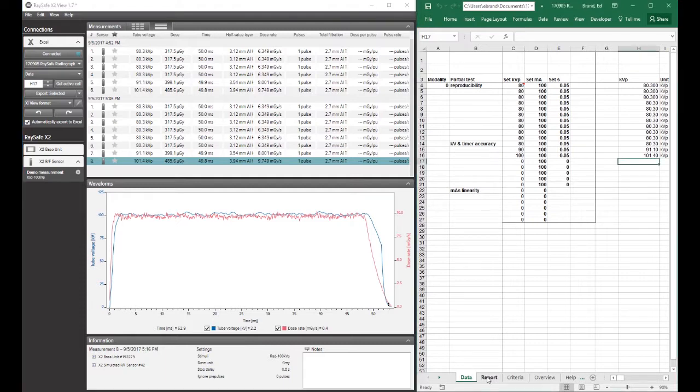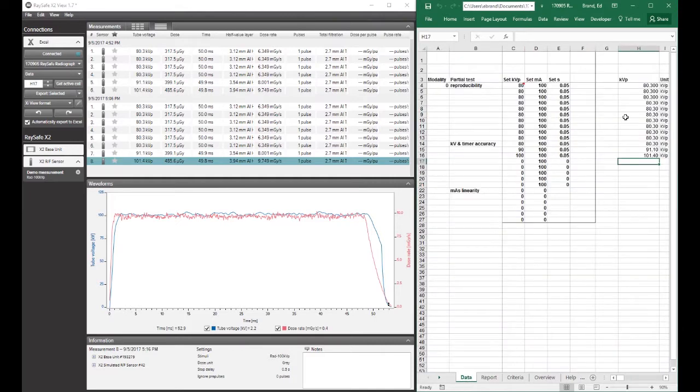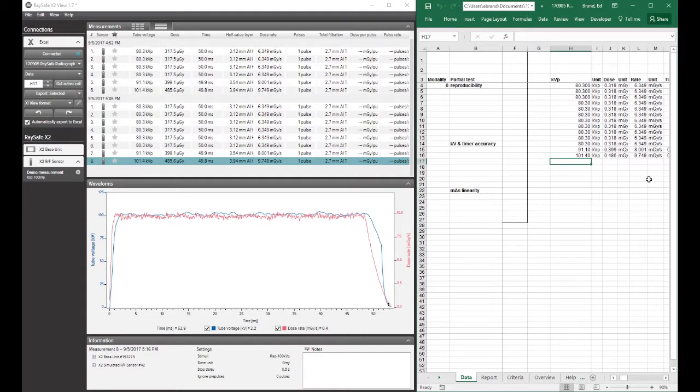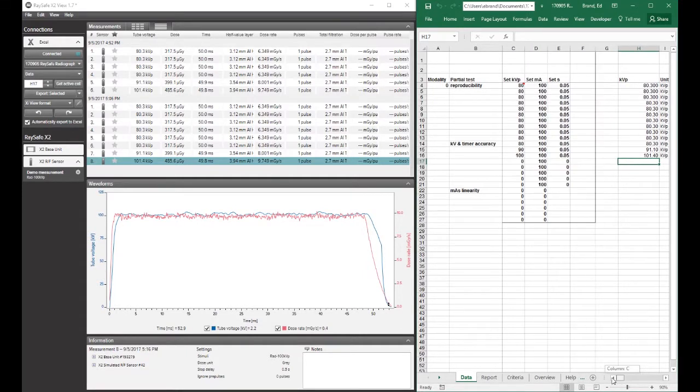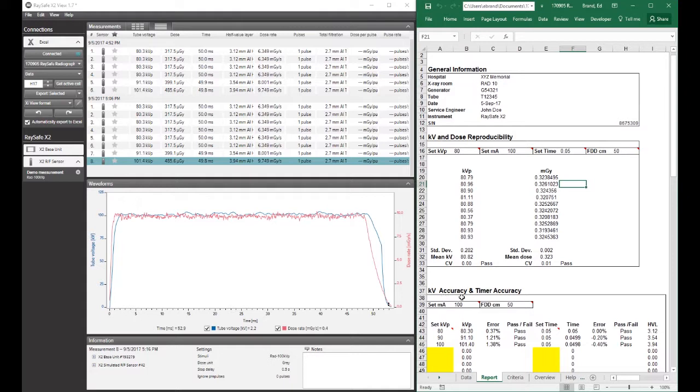So let's look at the report that we've generated now. So you'll notice that in the data, the kVp numbers here for the reproducibility, and if you could see the dose numbers, which I'll scroll over so you can, it's all the same, right? Because they're just simulated exposures.